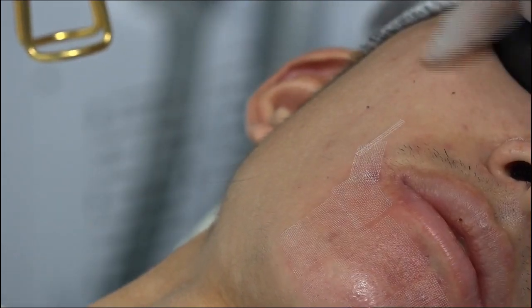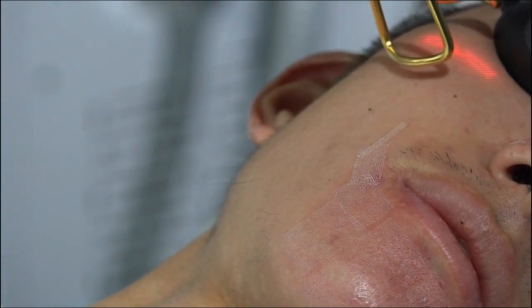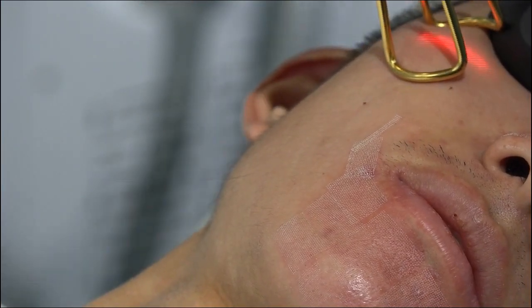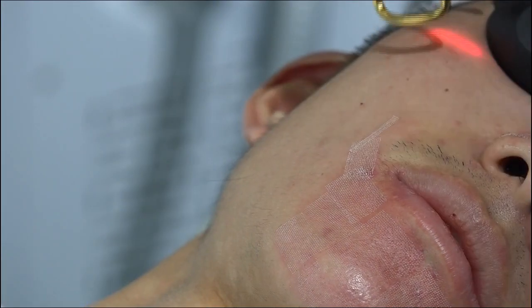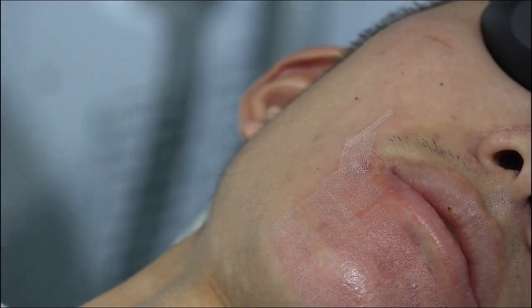And also we have a scar here. So we put the handle like this. Okay, now I will change the shape. Okay, now it's okay. Ready.